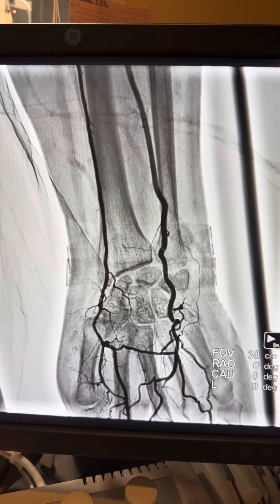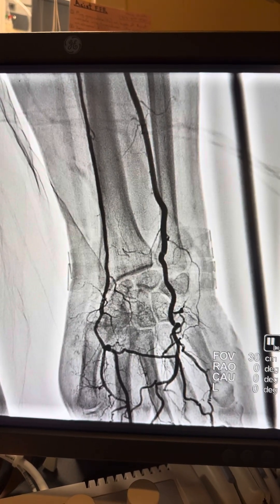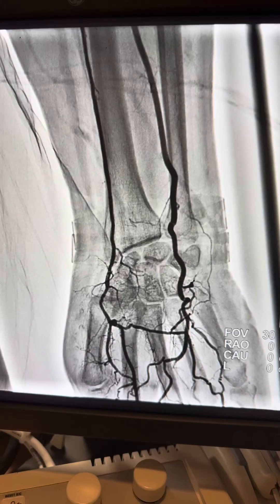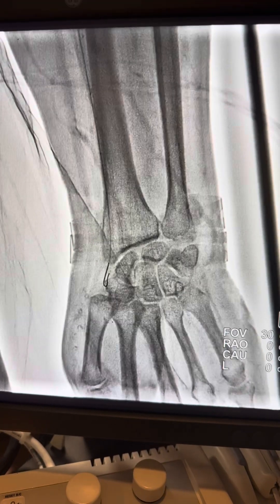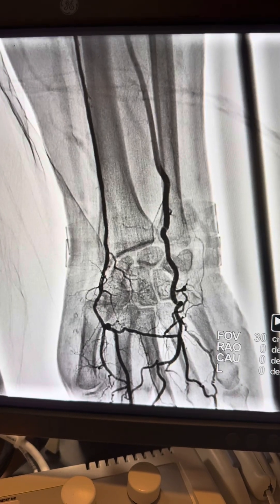No stenting was needed — no residual stenosis or dissection — and we have nice flow throughout the whole hand. Thank you and have a good day.